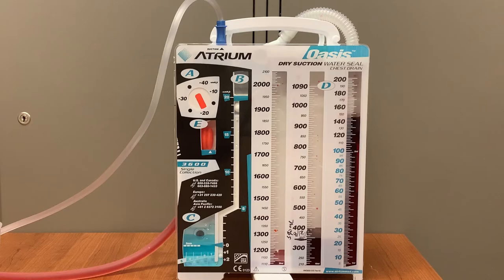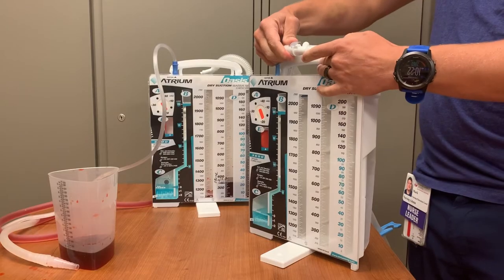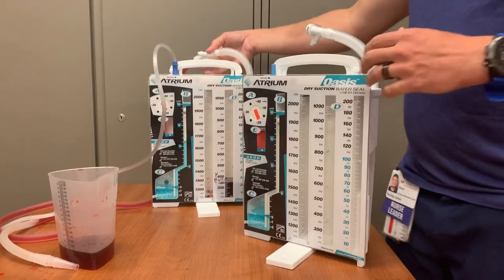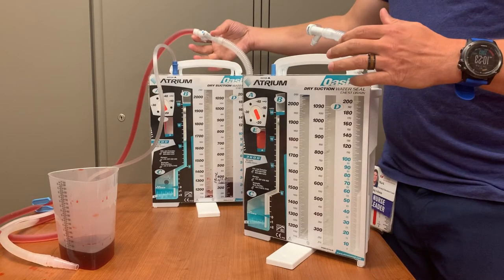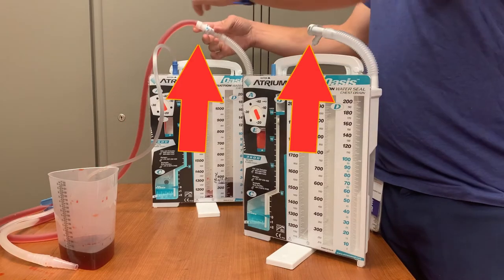If the Oasis is ever cracked or damaged, change the system and attach a new Oasis as soon as possible. To change the Oasis, simply open a new Oasis kit from the pod room. Prime the system with the provided sterile water, then remove the tubing that is attached to the new Oasis system — you will use the tubing from the previous Oasis. You only need to replace the Oasis container, not the tubing. You should never need to remove the tape or disconnect the connection from the Oasis tubing to the chest tube. You should only be using the inline connector when exchanging Oasis units.